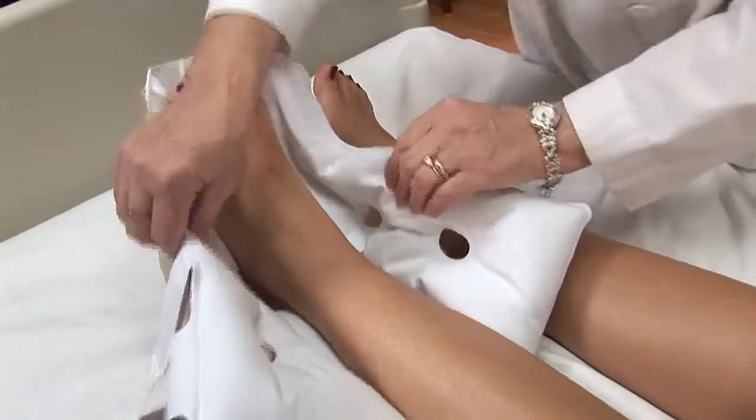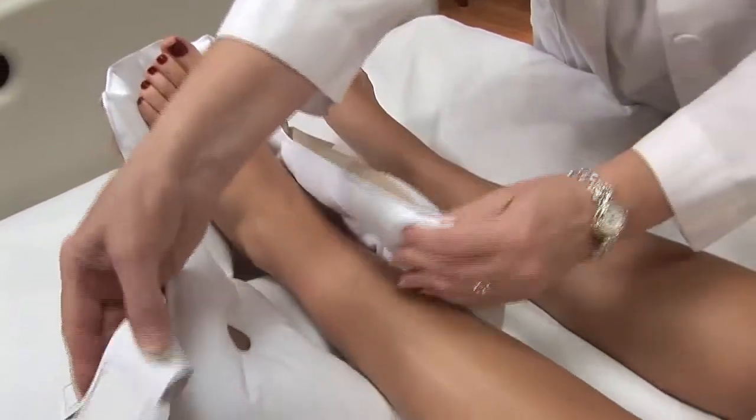I put it on you the same way that we put on the waffle boot. Slide your foot in there. Make sure your heel is properly elevated off of the bottom. Secure the straps.